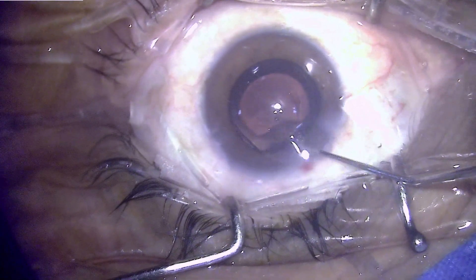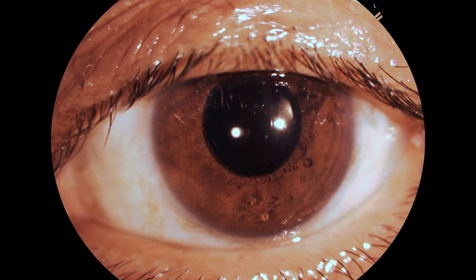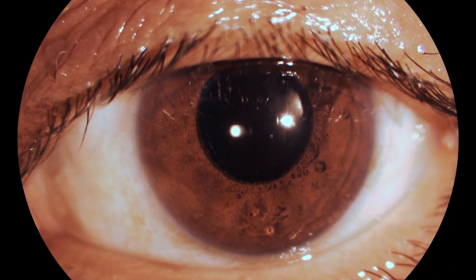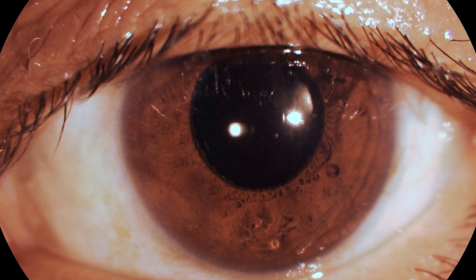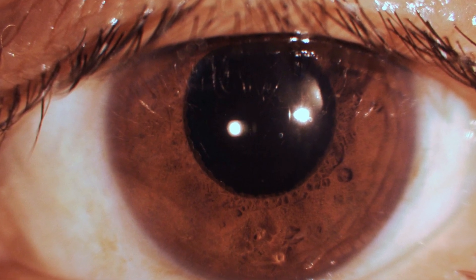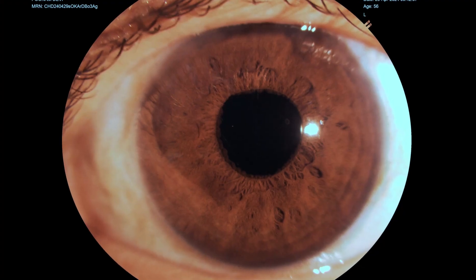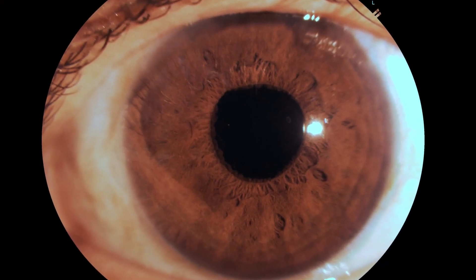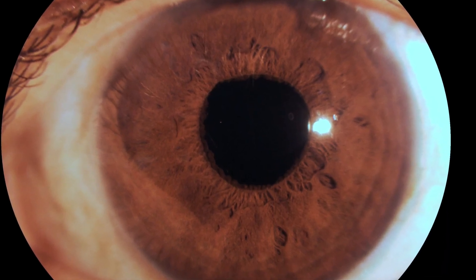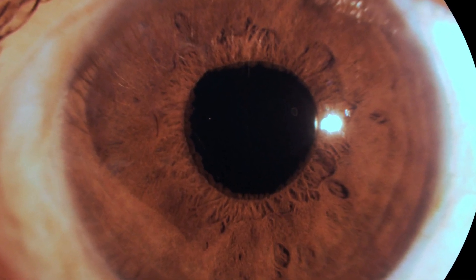This finishes the surgery. This is the day one post-op picture, which shows a very clear cornea in spite of having a hard nuclear cataract. And this is the final picture at day seven, which again shows an excellent outcome. Thank you.